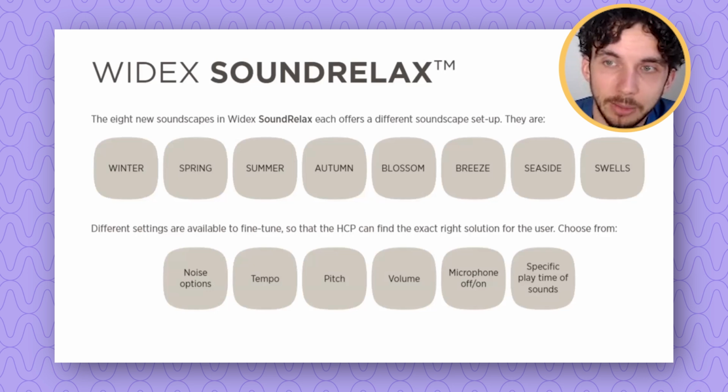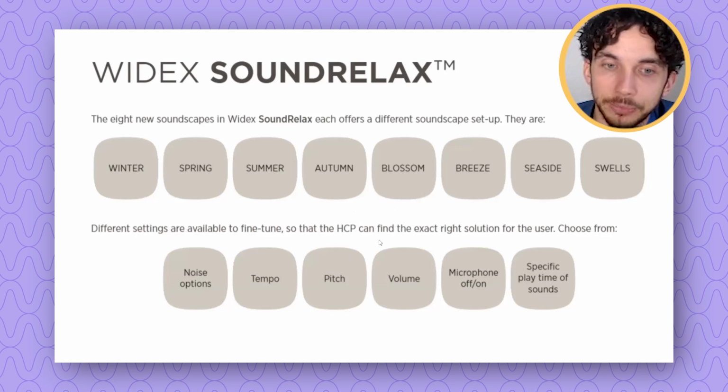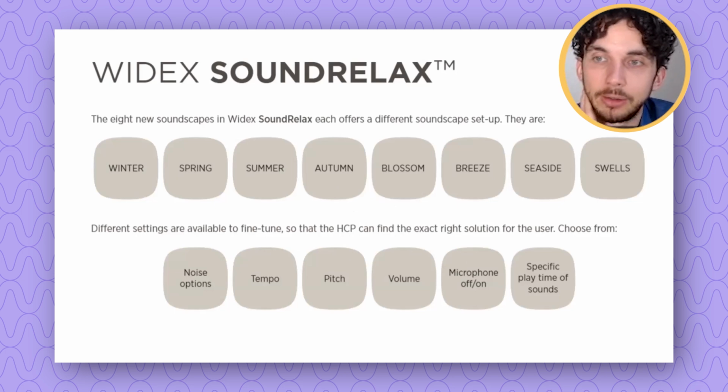who can choose the one that works best for them and then have it played in their ears in a way that's providing relief from tinnitus. In addition to simply choosing the sounds that mix in the best with your tinnitus, individuals can also adjust things like the sound quality, the pitch, the volume, the timing of the sounds. And then the audiologist on our side of it, every time that we meet with a patient via telehealth, we are adjusting those devices to provide the maximum benefit and customize it for your needs.